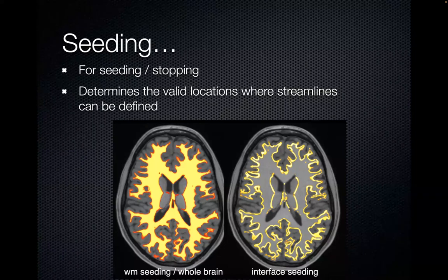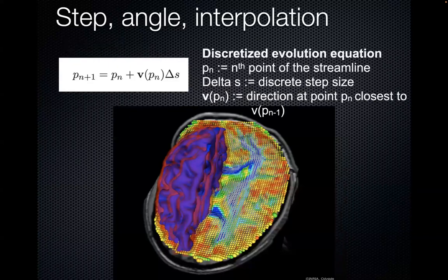That's a technology we introduced in my lab and that we brought to Obay and Habib, but we can actually use the surface of the cortex and the normal to this surface to start tractography. Then tractography is super naive. Once you have a seed, basically you just need a way to discretize space and follow pixels, or follow the DTI principal eigenvector. That's the most naive approach.